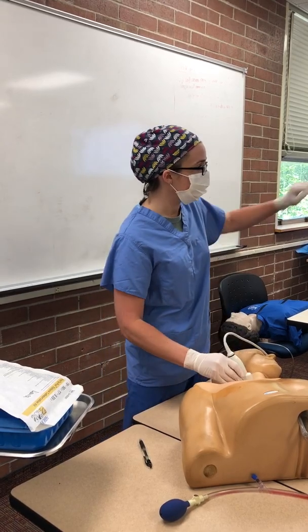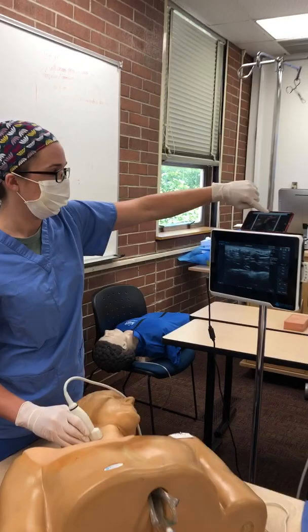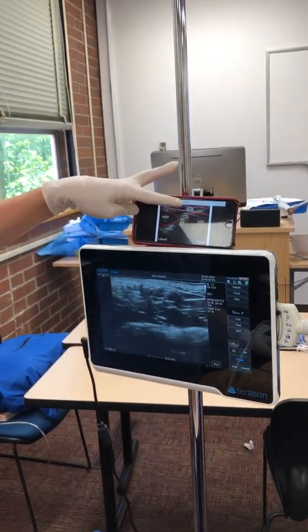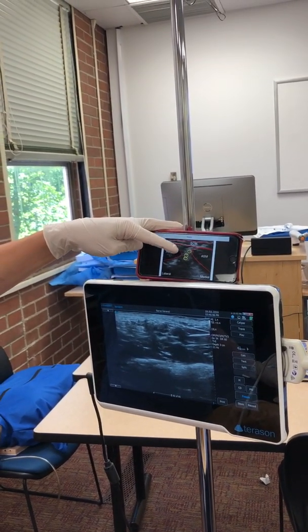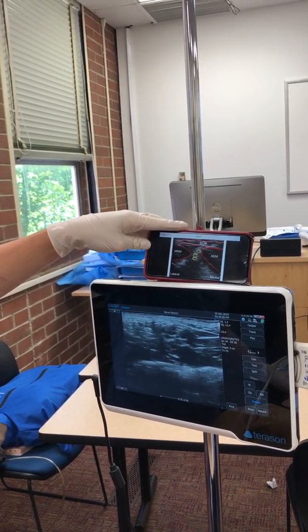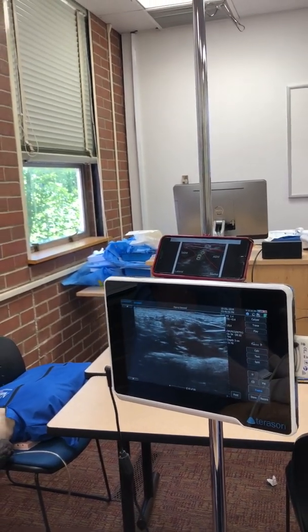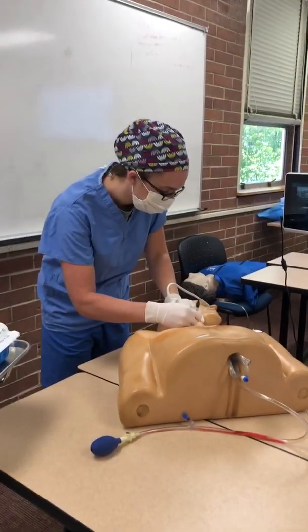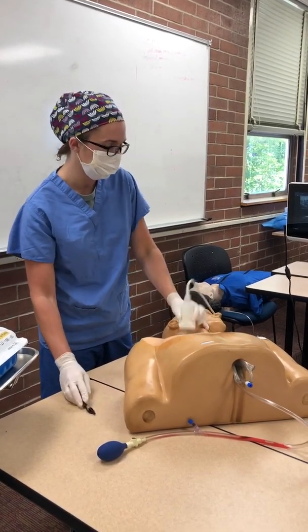Just looking at the ultrasound here, what I'd be looking for is the sternocleidomastoid kind of on the top here. To the right would be the middle scalene muscle, and to the left, more medial, would be his anterior scalene muscle. In between those, I should see a stoplight appearance of C5, C6, and C7 nerves. So again, I would just scan up until I had a good view of that. At that point, I could go ahead and just roughly mark where that ultrasound probe was so I can find it and put the drape on appropriately.